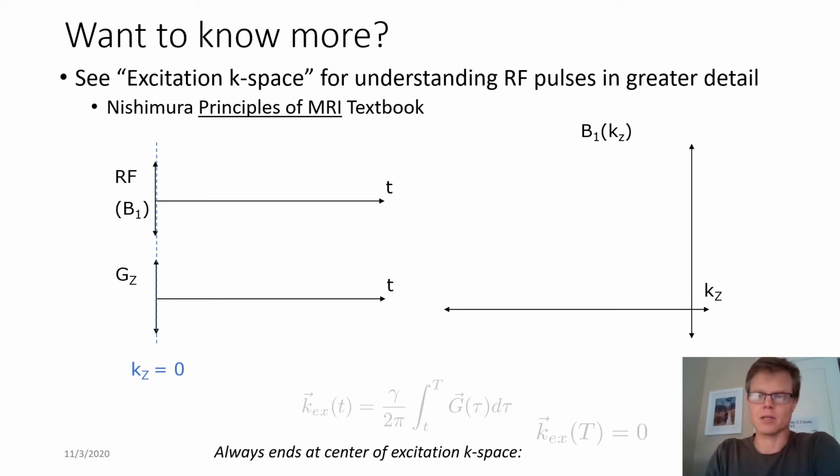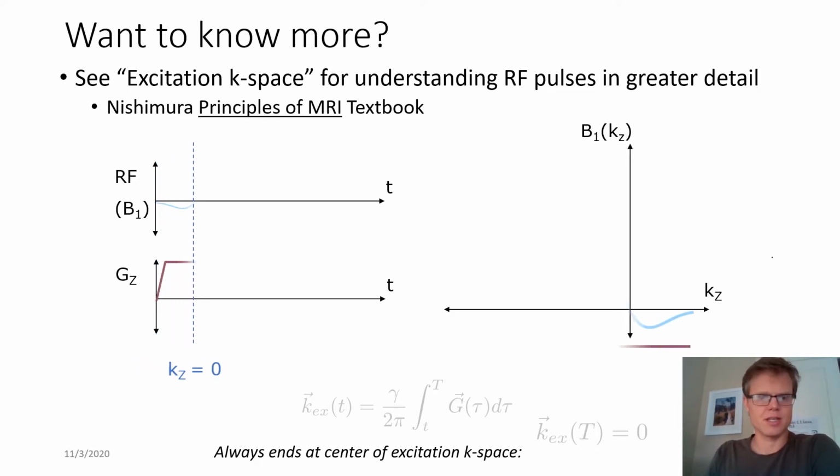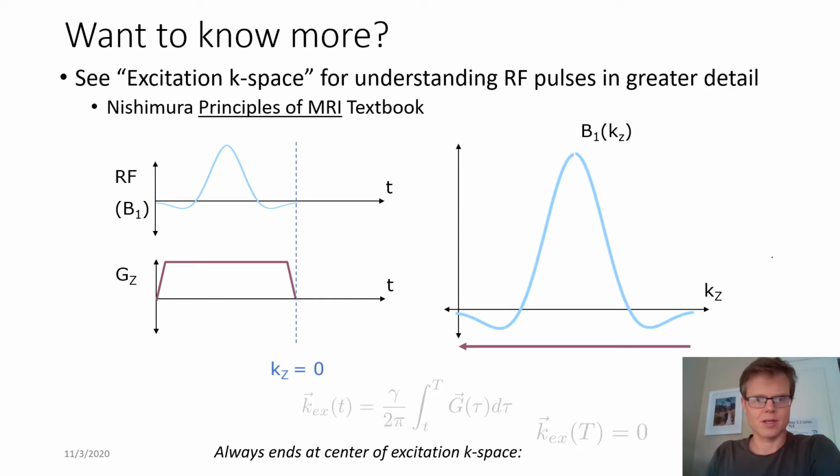You can actually expand this in some other ways and use this concept of excitation K-space.